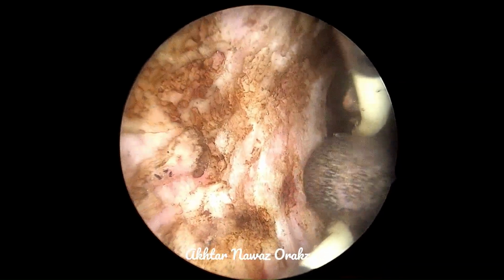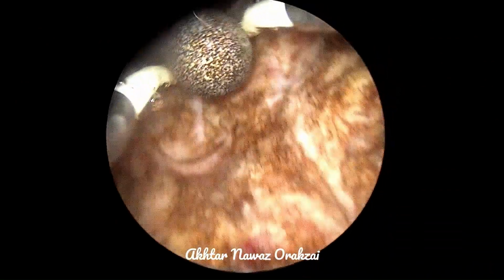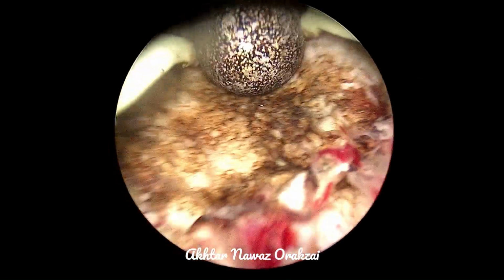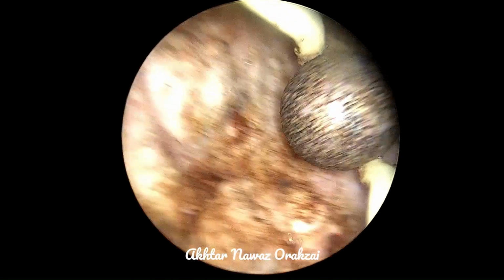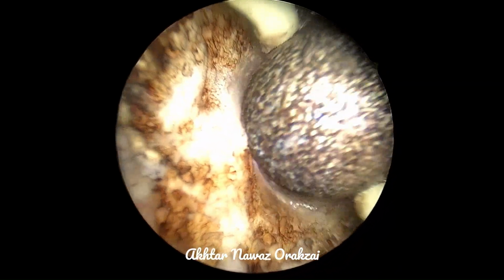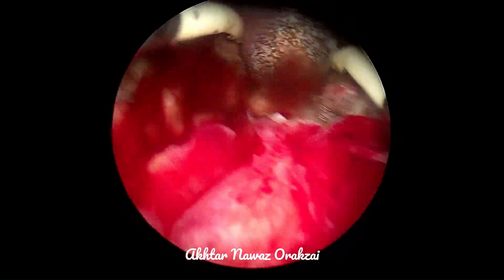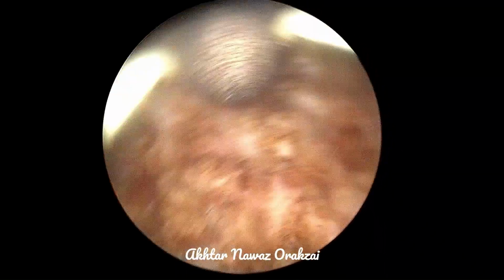Care must be taken coagulating the flaps of the prostate near the verumontanum. As I already discussed previously, this may lead to, number one, incontinence, number two, urethral stricture formation. If no active bleeder is there, there is no need to coagulate this area, as a 22 Fr 3-way Foley catheter will snugly fit into this portion of the urethra, and the small bleeders, if any, will be stopped by the tamponade effect anyway.